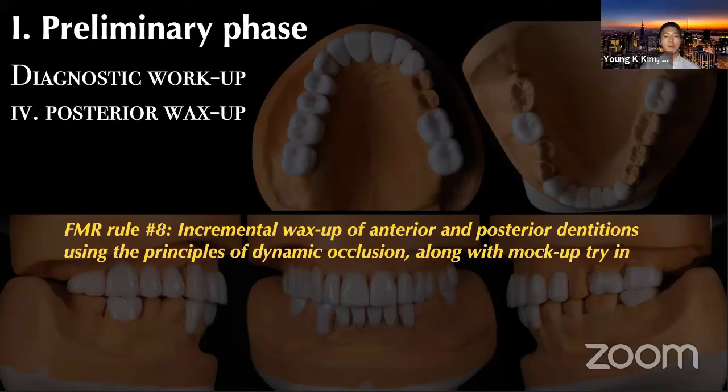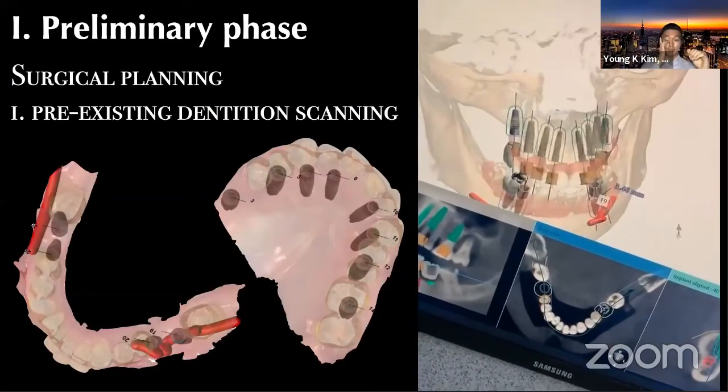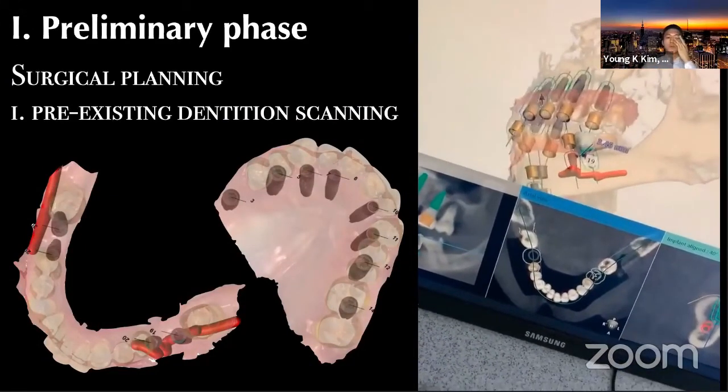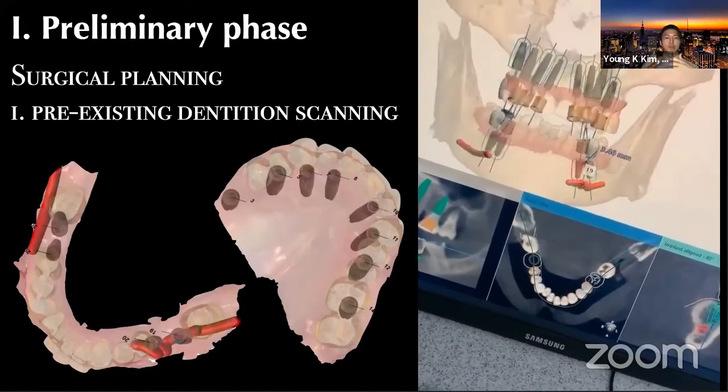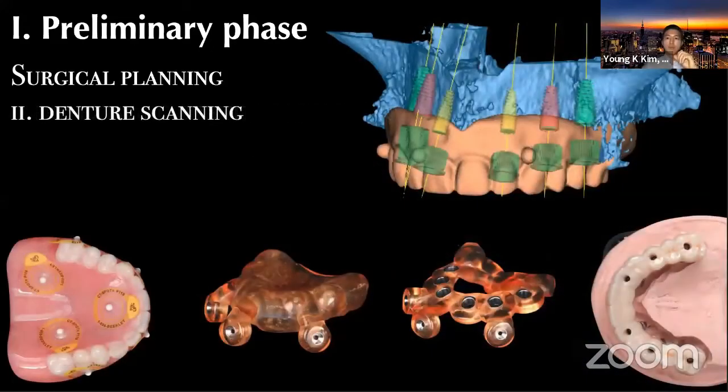And then finally, we are moving on to the surgical planning. Today's lecture is not a surgical lecture; it's more like full mouth reconstruction in general. You can utilize a pre-existing dentition for scanning, or you can use a denture when the patient is missing the dentition. You can dual scan a denture, and that gives us the basic framework of the tooth position, and you can plan the implants, initially with a tissue supported guide and converting into a bone supported guide, and you can precisely do the osteotomies followed by placing the implant fixtures.